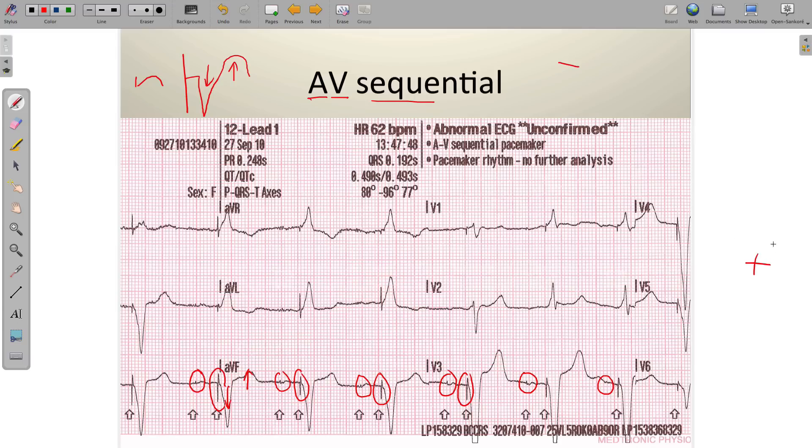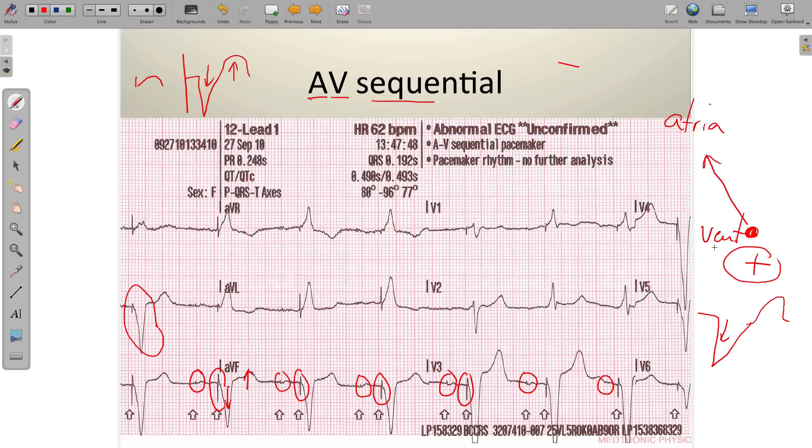Think about this: in lead II, the ventricles are down here and the atria are up here. With a ventricular pacemaker, the origin of the stimulus comes from down at the level of the ventricles, and that depolarization moves upward — away from the positive lead. So in lead II with a ventricular pacemaker, the wide QRS complex should always be negatively deflected because the force is moving away from the positive lead, creating a negative deflection. Then we get discordance between QRS and T — an important finding we'll discuss in more depth in a different video.